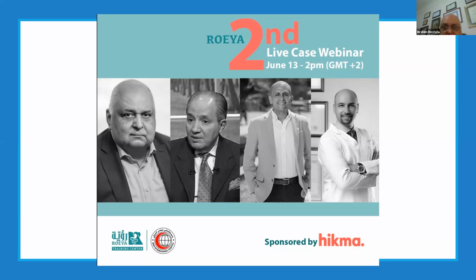It's better. We can use another stent, either plastic stent, multiple plastic stents, as Mustafa said in his lecture, or another self-expandable, totally covered metallic stent, and leave it for a longer time. According to the literature, if after 1 year of dilatations and stenting the stricture recurs again, there is no way except surgery. But this is after multiple trials of stenting or dilatation.